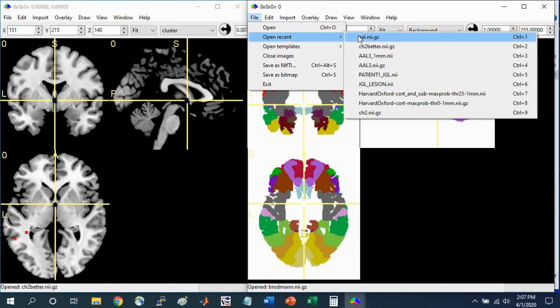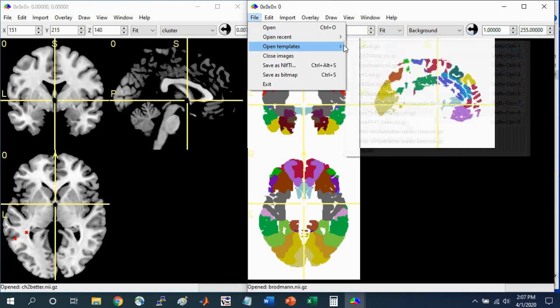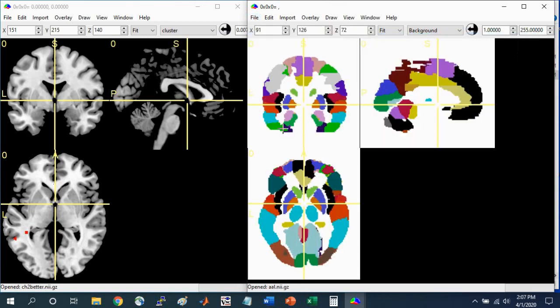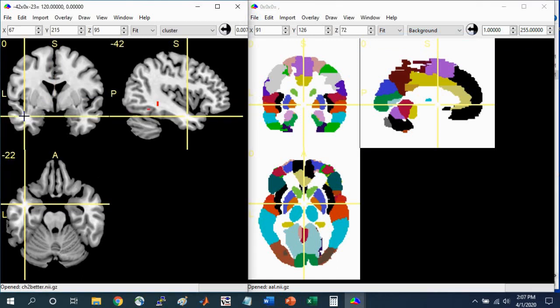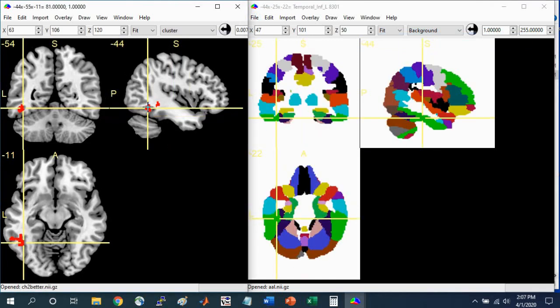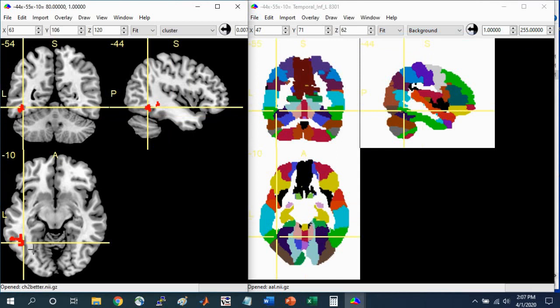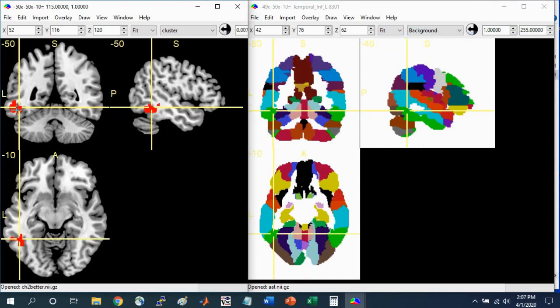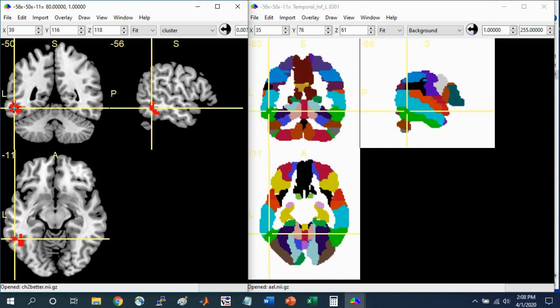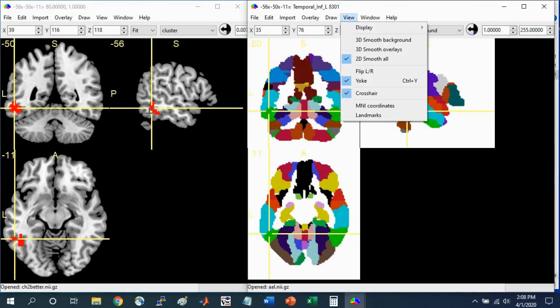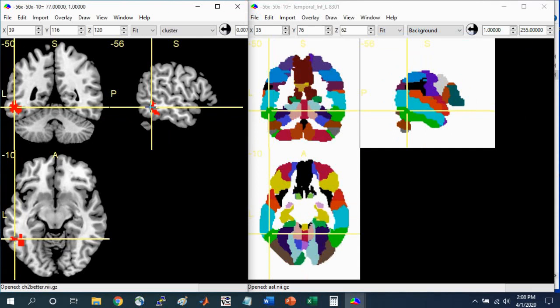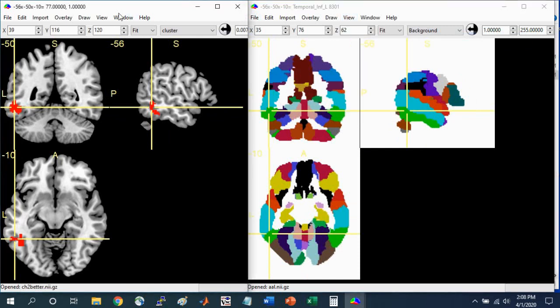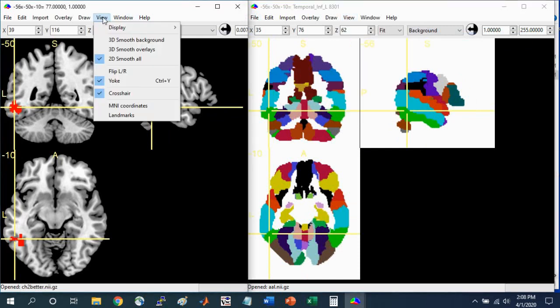Let's go and open the AAL Atlas and navigate to the cluster that we're interested in. Here on the left, I'm just navigating to the cluster and clicking on it. One thing to note is that you need to make sure that these two windows are yoked. As you click a coordinate in one window, it should jump to that coordinate in the other window if they're both yoked. Go to View and make sure Yoke is checked in both windows.